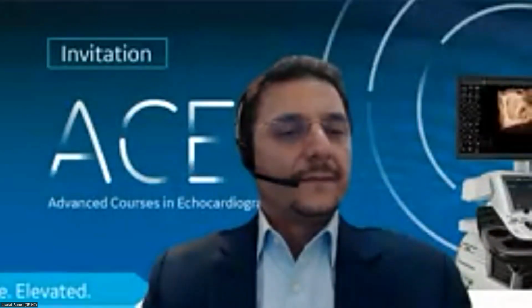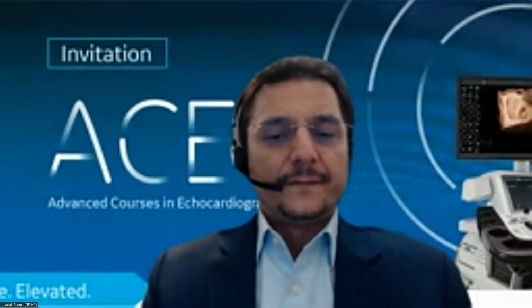Yes, sure. You raised it perfectly, because in practice we usually use ejection fraction and other parameters to see whether the patient has improved with the treatment or not. But technically, it's not easy to identify the change with treatment, because they usually have a global poor function or hypokinesia. It's a global form. So taking a simple ejection fraction, or fractional shortening, doesn't actually help us in following patients. It can be used the first time to diagnose and to help you start treatment. But during follow-up, I think strain testing can help. That's the feeling I have, because I don't usually use the strain test, and I wanted to see how it potentially helps in following patients after we have had a diagnosis and started treatment.